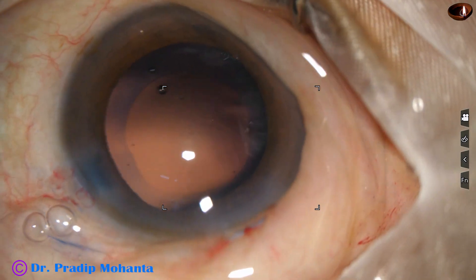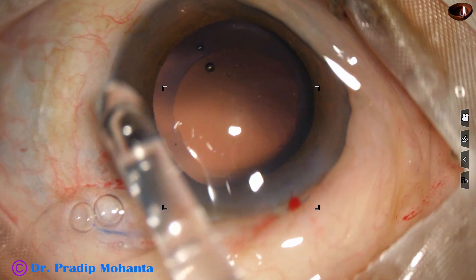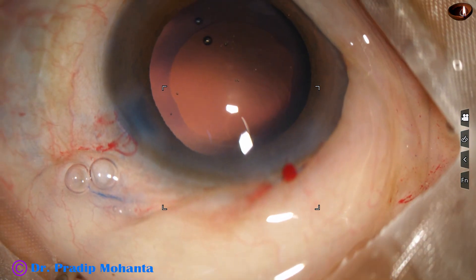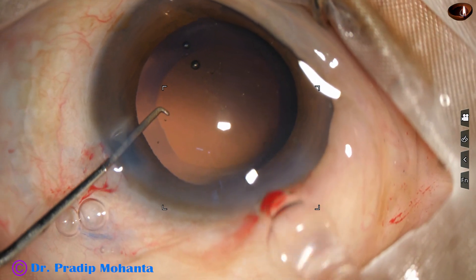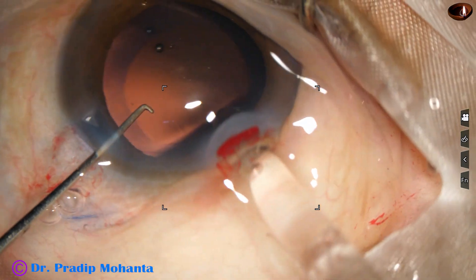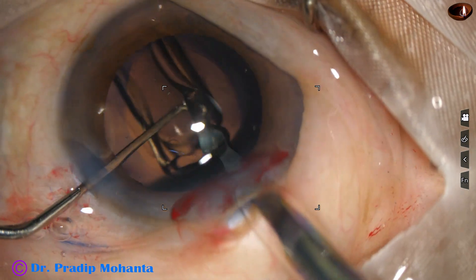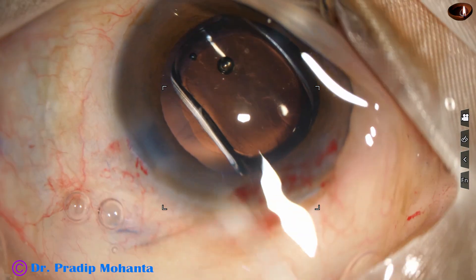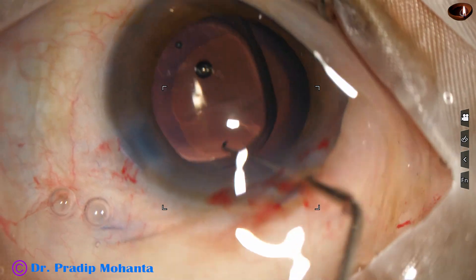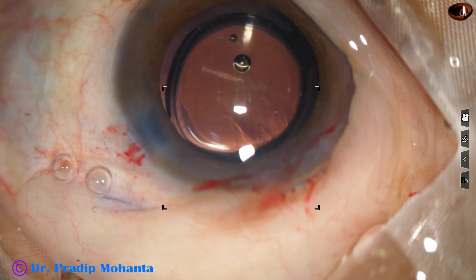I enlarge the main wound a bit because I am going to use a B cartridge. The lens being used is Technison from Johnson and Johnson — a beautiful monofocal lens. Now the lens is dialed and placed in the capsular bag.